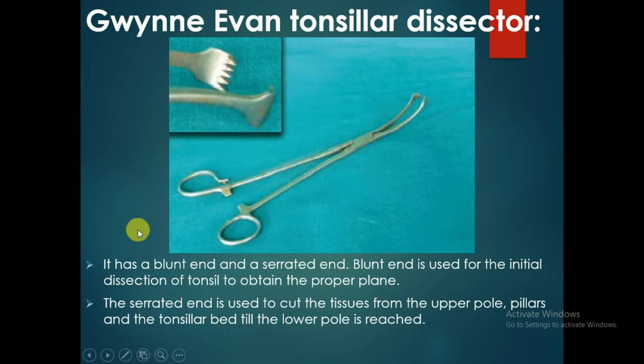This is the Gwynne Tonsillar Dissector. It has a blunt end used for initial dissection of the tonsil to obtain the proper plane. The serrated end is used to cut the tissues from the upper pole, pillars, and the tonsillar bed.